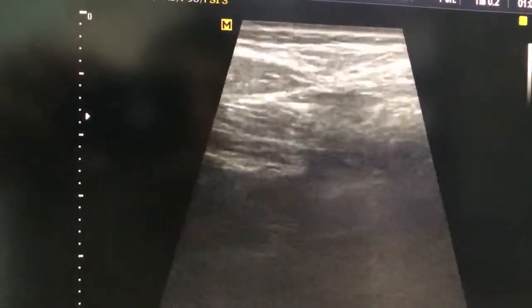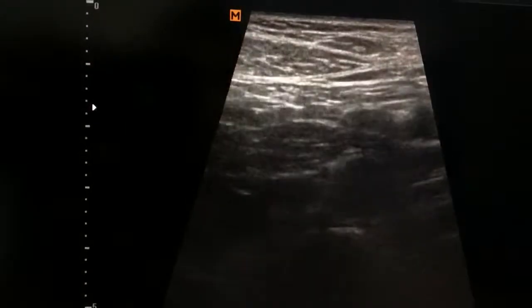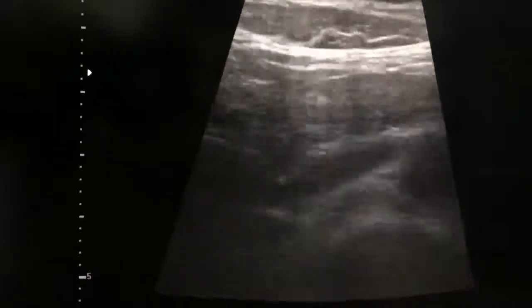25 years female complaining of pain in abdomen, mild pain, and diarrhea since 1-2 days. No fever, no vomiting. Just first episode. No such previous episode in the last 5-6 months.